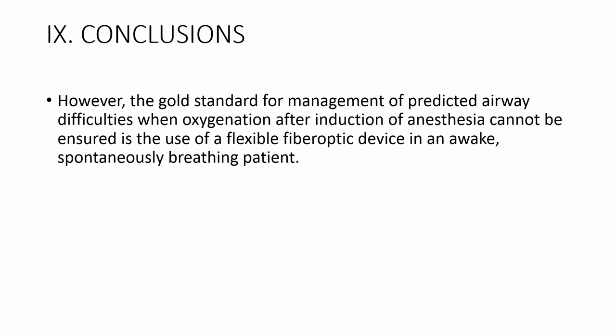However, I think you should always remember that the gold standard for the management of a predicted difficult airway when oxygenation after induction cannot be ensured is the use of flexible fiber optic device in an awake, spontaneously breathing patient. That's the bottom line when it comes to airway management, and that's the conclusion in that chapter. There's much to be gained by reading that chapter.